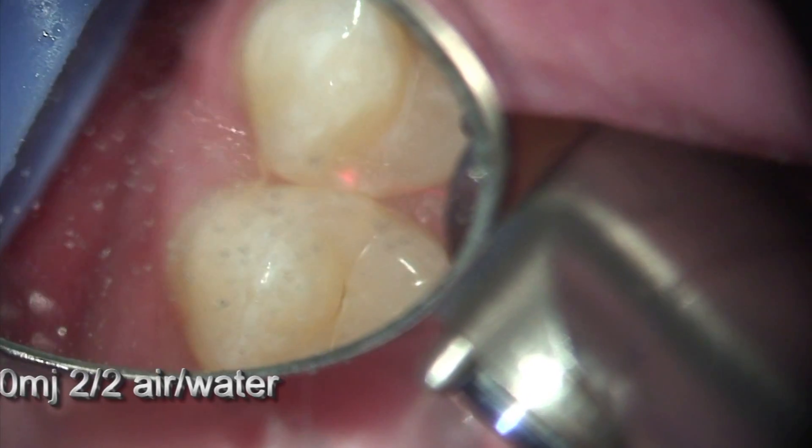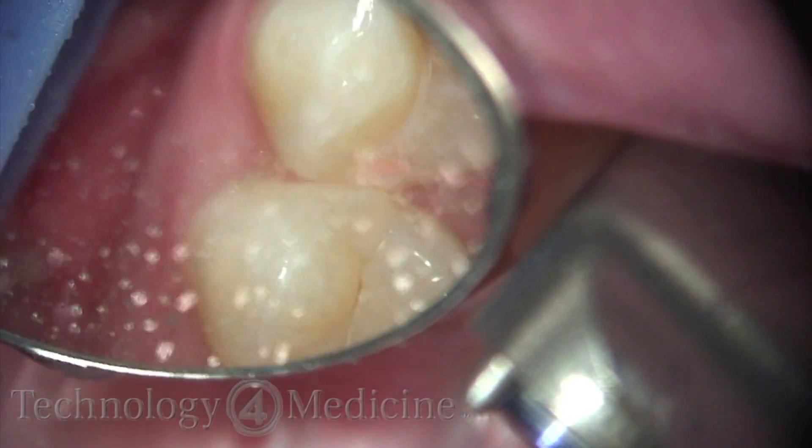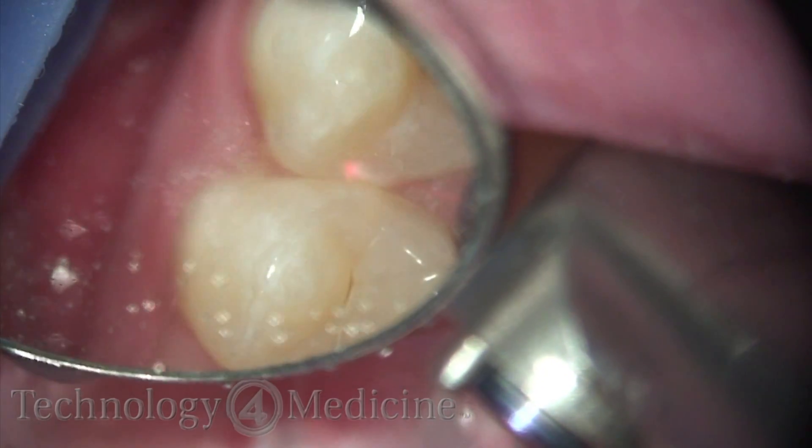Due to the histology and the way the enamel rods are placed, the laser is very efficient in a Class 2 preparation, no matter what the size.